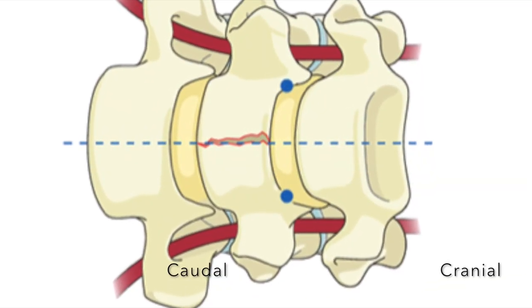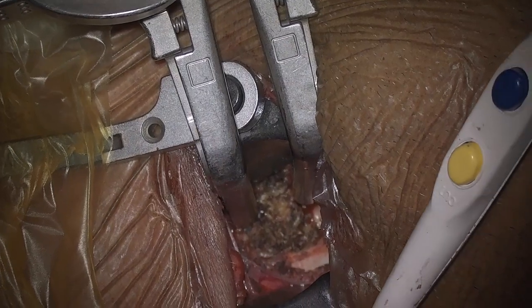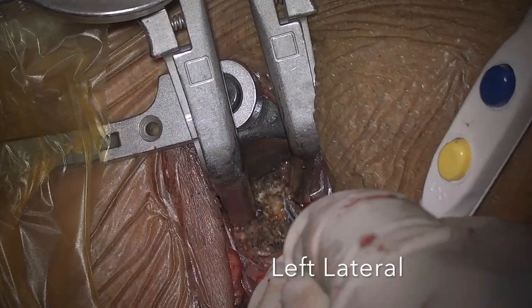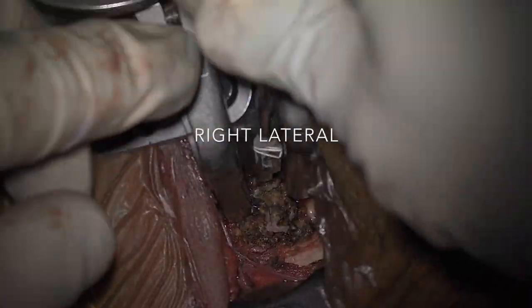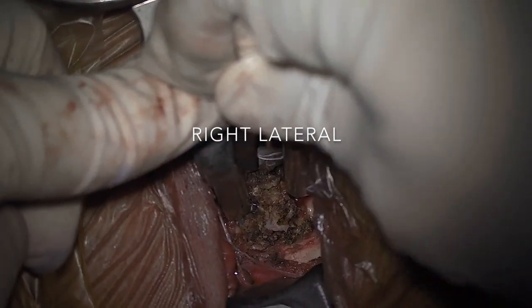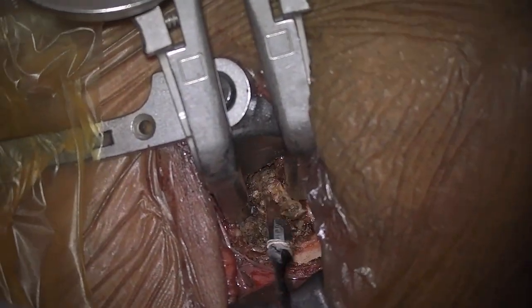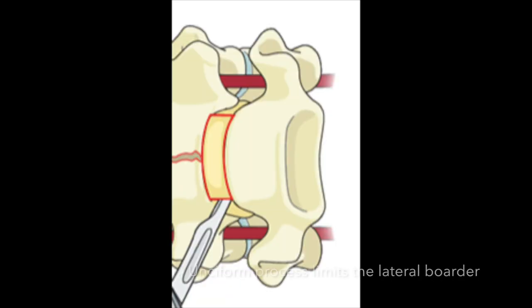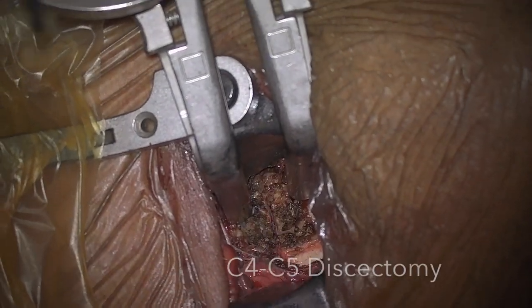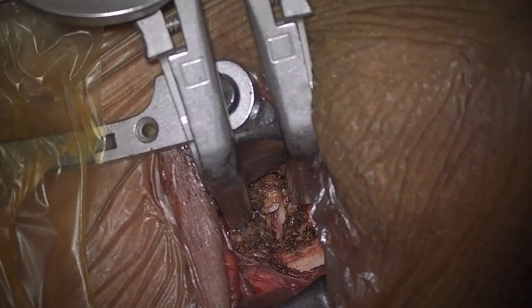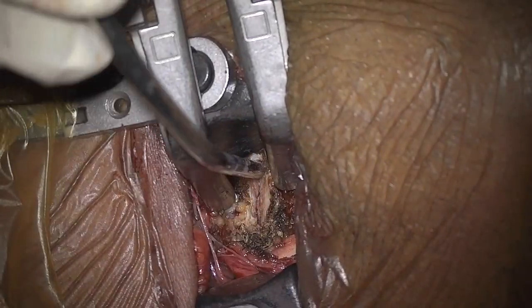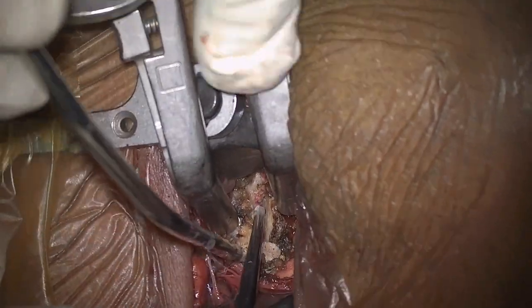The right side of the screen is the cranial end; the left side of the screen is the caudal end. The surgeon is standing on the left side of the patient. A number 11 blade is used to start the discectomy. The uncovertebral process determines the lateral limit of the discectomy.